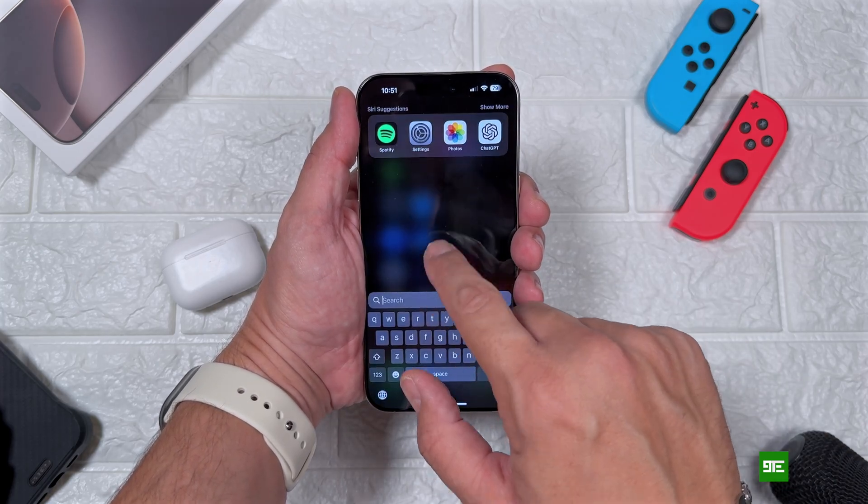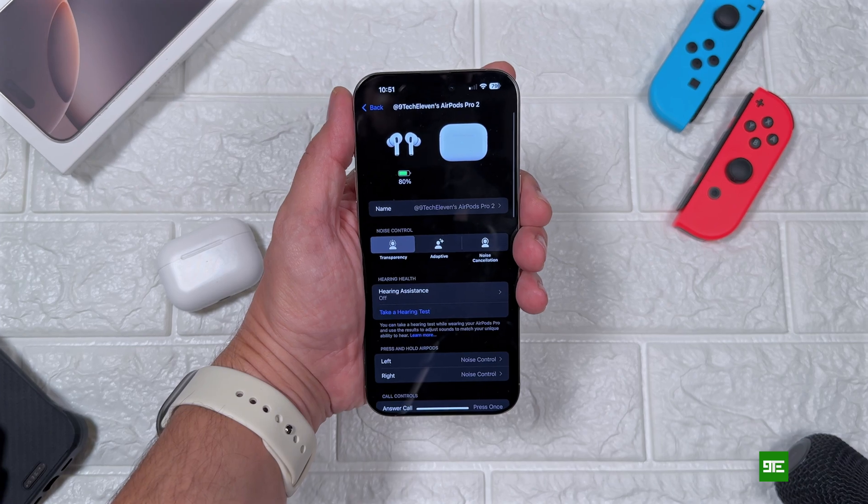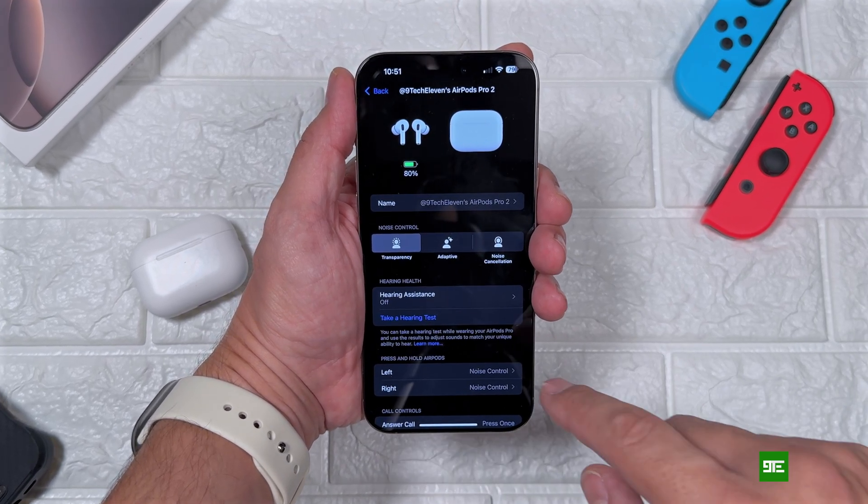Apple has released iOS 18.1 RC, which means that the highly anticipated hearing assistant feature has arrived with your AirPods Pro 2. Let's go through the setup process together.